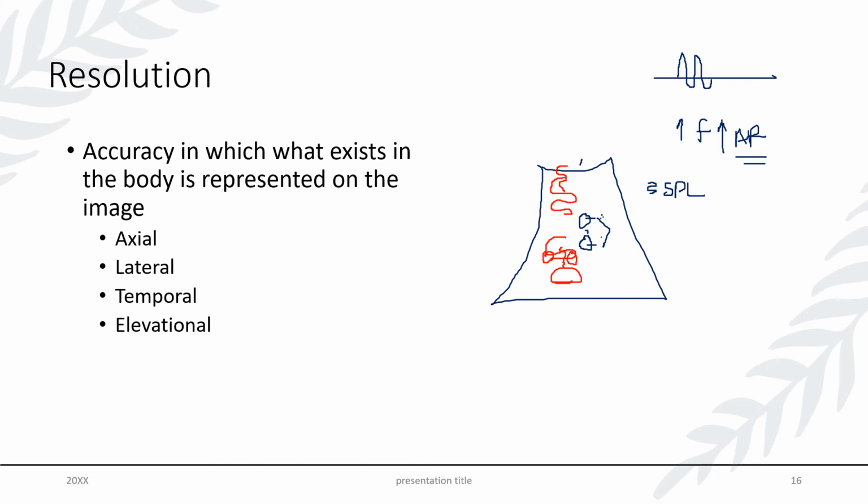Now, we haven't talked a lot about this yet, the way we control this is with our focus. As an operator, you're always wanting to find your focus button, and we can show you that if you're not familiar with it, but you want to maintain the focus usually at or just posterior behind the anatomy that you're most concentrated on. Say you're scanning a liver, you want to know what's going on in the whole liver, then you would put it at your far field or just posterior to the area you're looking at.